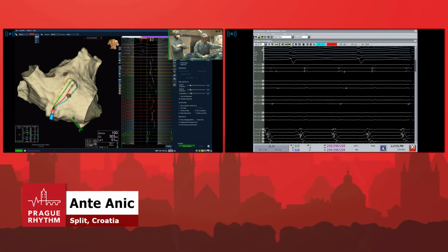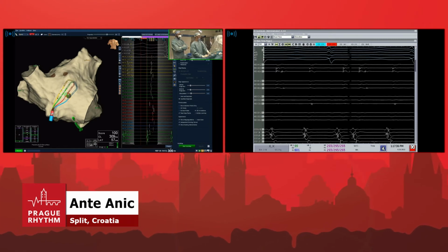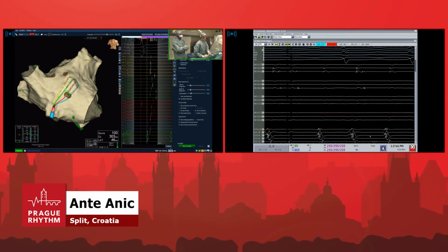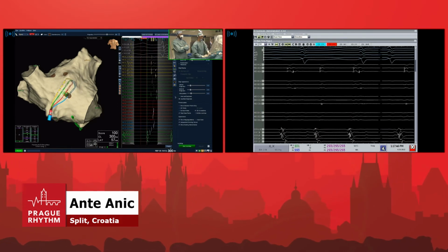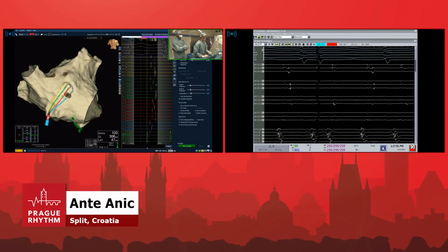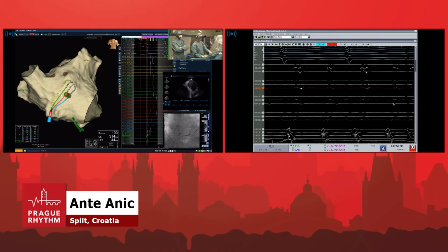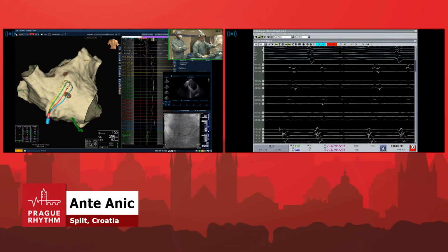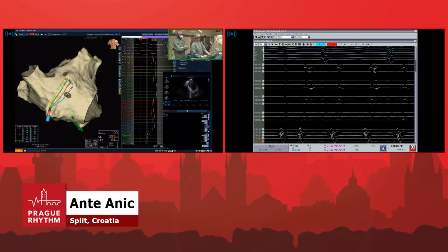Is it at the same spot where we had this before? So let's prove it. Can we try entrainment from A34? Mariska, can you try to entrain from C34? Very low activity. I'm going to try and improve the catheter contact, but yeah, unlikely that we're going to capture. Now, Mariska, stop, please. Can you entrain from A34? A34. Please, entrain from A34.